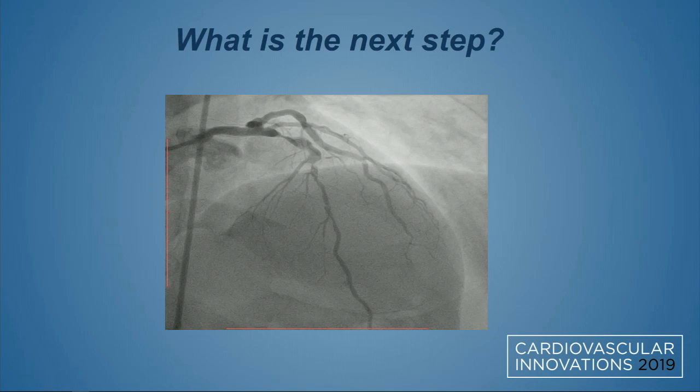So if you were in my place, did you stent directly or do like I did? Did you hear what she suggested? That's a very good suggestion, because you don't really know if you are in the true lumen or not, because you're not seeing and then you have difficulties manipulating the wire. The other thing I wanted to mention is that if I was sure, because I'm not, that this was an aneurysm and this is a young patient, I wouldn't be hesitant to call a surgeon to do an off-pump LIMA to LAD and close down the LIMA at the aneurysmal segment, or fix that too.